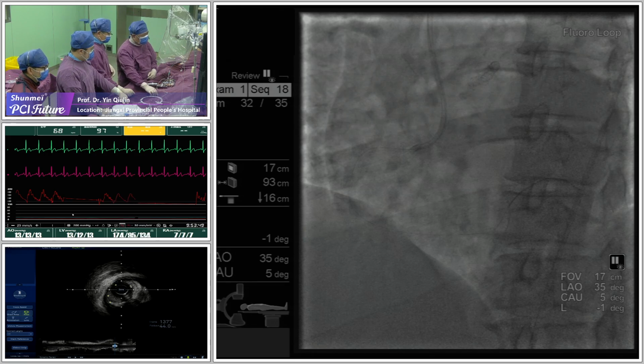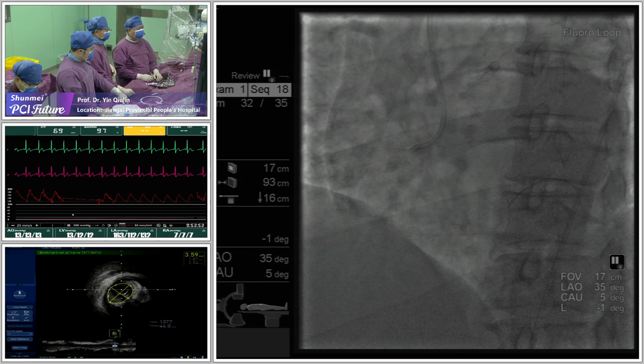Deflation? Dr. Chen, 16. Dr. Xu from Fudan. Dr. Chen? Hey. Hey, Dr. Xu Zhaoyan.